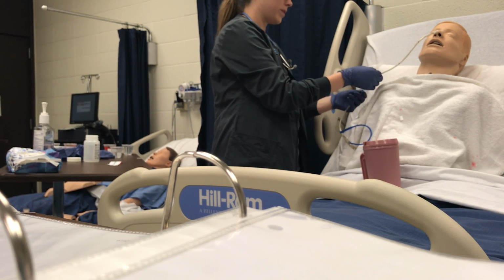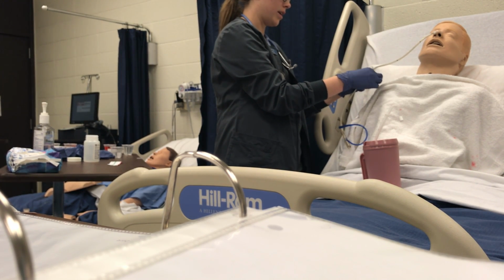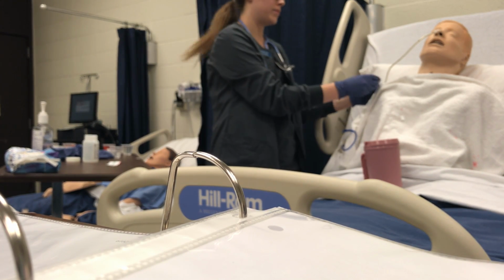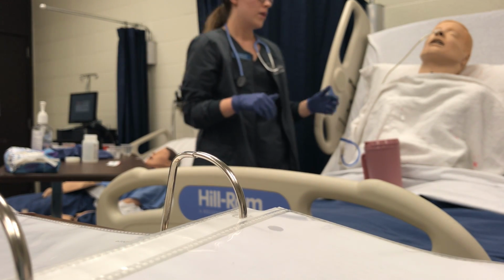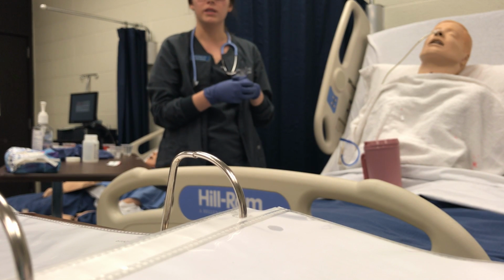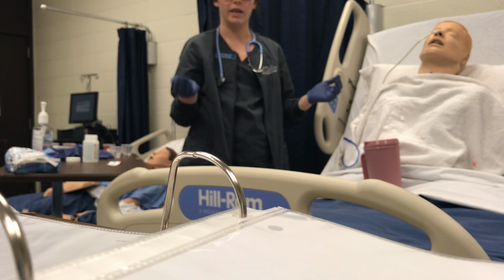I would leave enough room to where he could have a little freedom, but also just that it would not be straying away. So I would go ahead and pin that right there. And so once it was pinned, it was good to go. Sometimes it depends on policy protocol, you would hook it up to the suction. For now, I'm going to go ahead and leave it off because I'm going to administer medication.